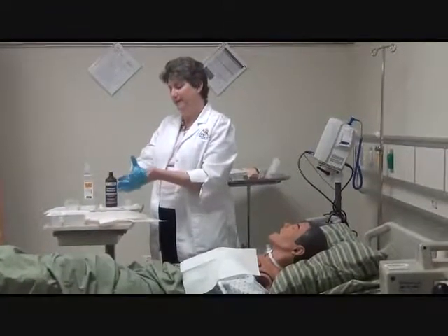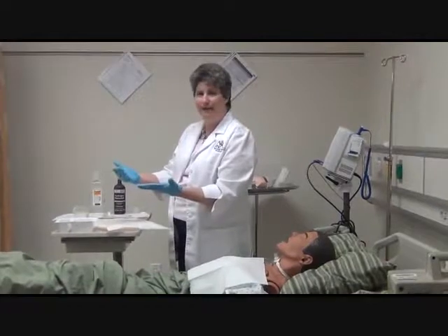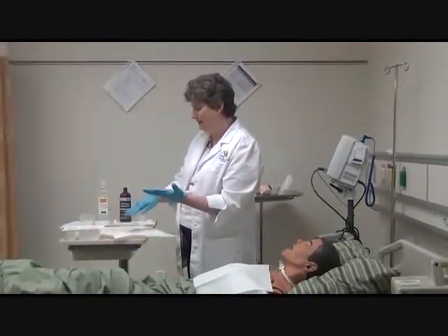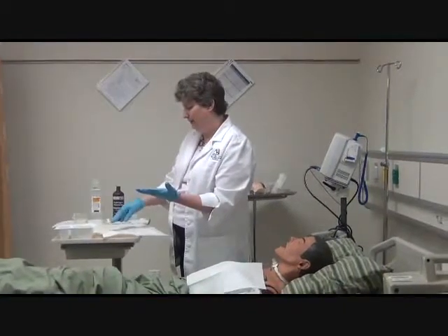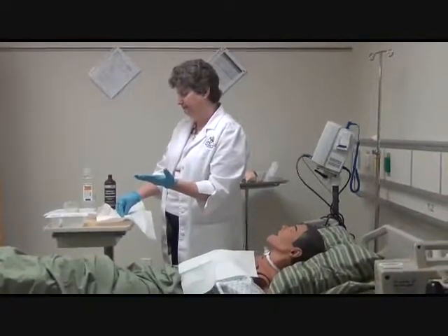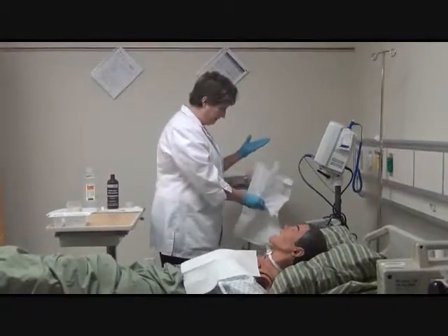If you get in the habit of putting them on that way, it's much easier. Now, I can keep this as a sterile field or get rid of it. And in this case, I'll just go ahead and get rid of it. Throw it in the trash can.